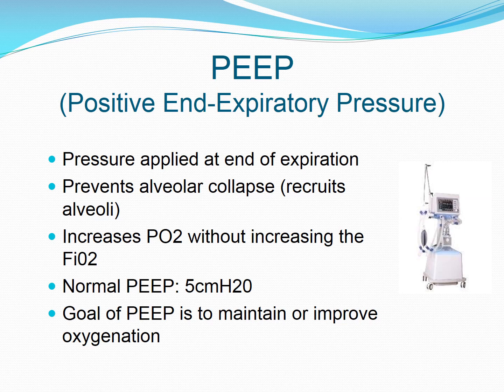So if the patient is unable to tolerate lowering the FiO2, so let's say the patient's FiO2 is 100%, and if we try to decrease that FiO2, the patient's oxygenation level decreases, based mainly on blood gases, but you can also check a pulse ox, then we have to add that PEEP. And the goal, as I said, of adding that PEEP is to try to keep that FiO2 lower and to also better oxygenate the patient. So there are some issues when you're talking about PEEP.